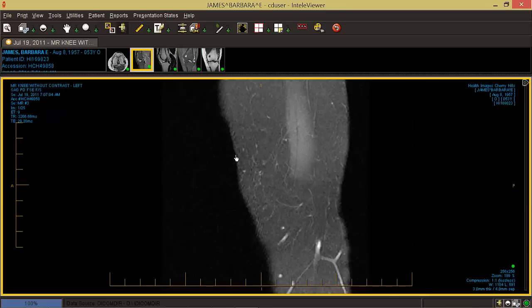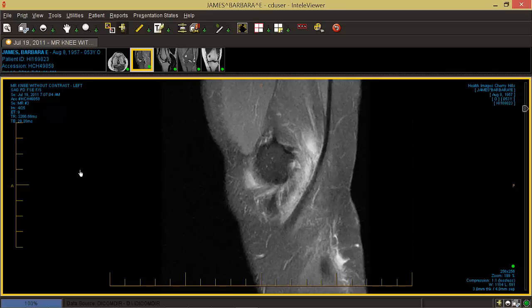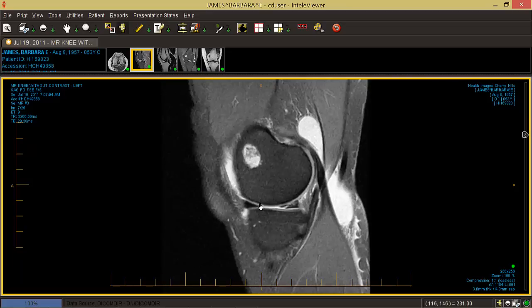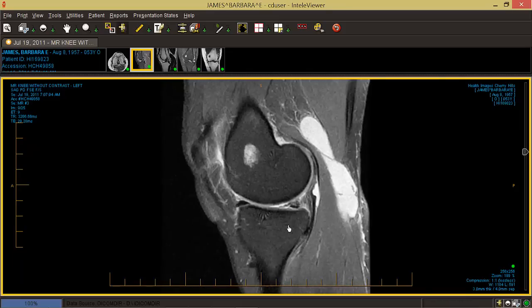Now let's look at the side or sagittal image. This one starts from the inside to the outside. We see some of the pes anserine tendons coming across, and a lot of white stuff — in this fat sat sequence, that white stuff is fluid, indicating swelling or effusion around the inside of the knee. We also see the meniscus triangles — the back meniscus and front meniscus on the inside. The light color in the meniscus again indicates a tear. As we go toward the very middle, there's more fluid in the back, which would be defined as a Baker's cyst.